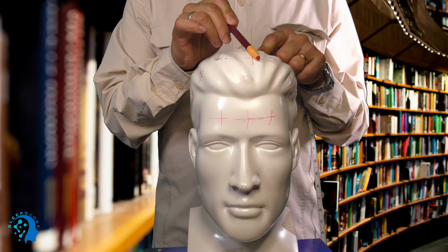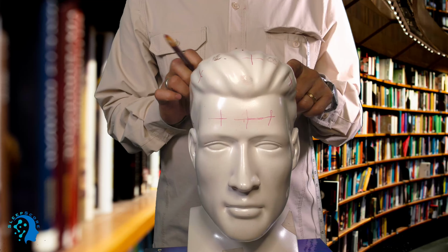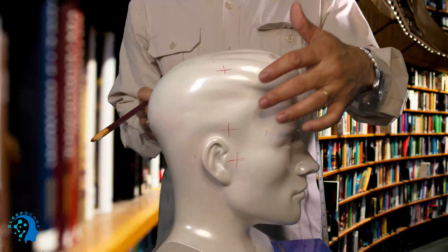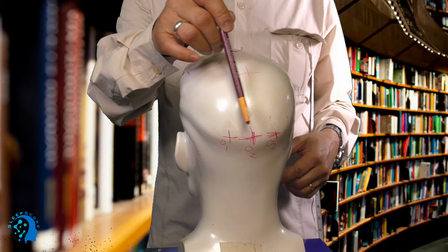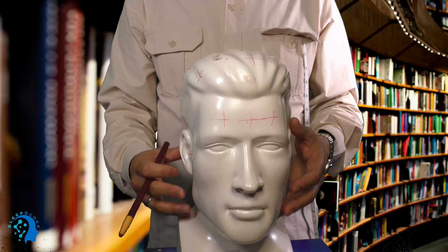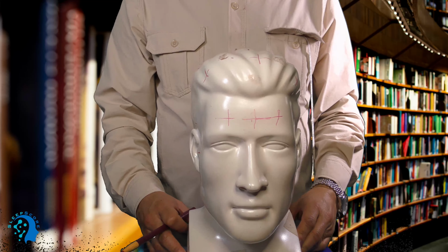This is my FZ, F3, F4, CZ, C3, C4, and this is A1, A2, and on the back I got my OZ, O1, and O2. Now this is it. This is how we do measurement. All right, I'm going to repeat one more time so that it makes it easier for you.